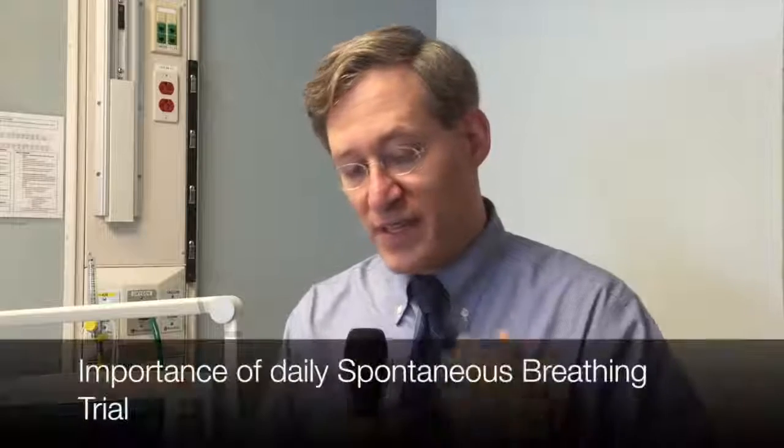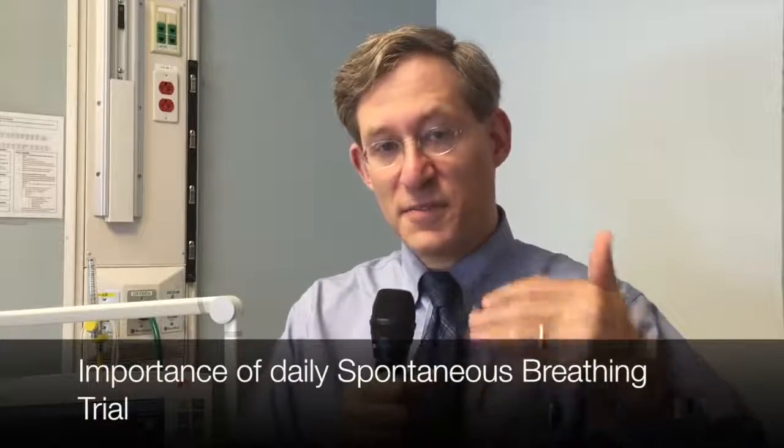The next thing I'd like to speak about, which is very important, is the concept of a daily spontaneous breathing trial. As we've talked about in some of the other videos, this is coupled with a daily sedation vacation.